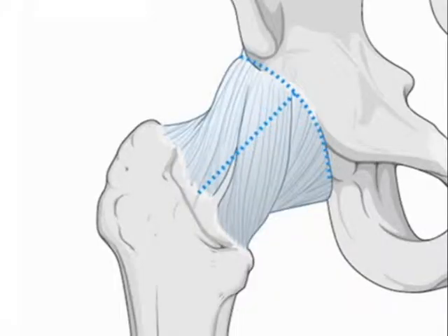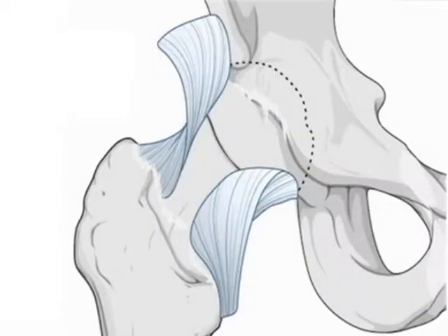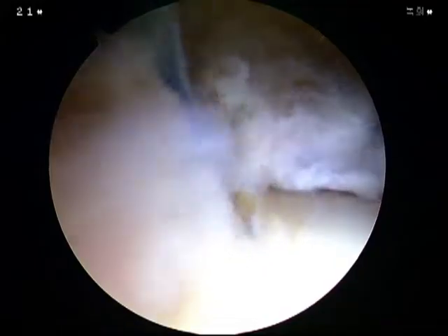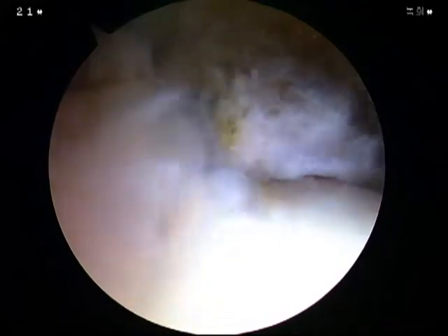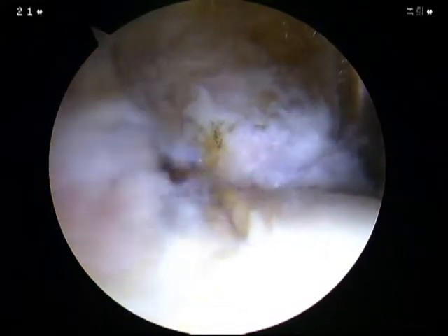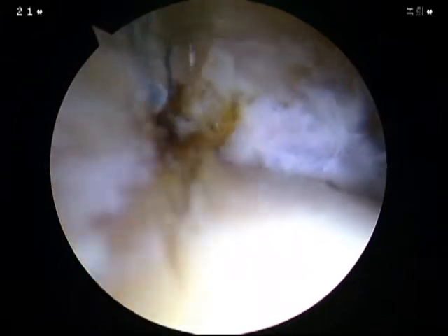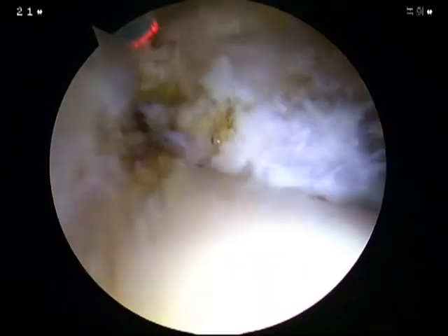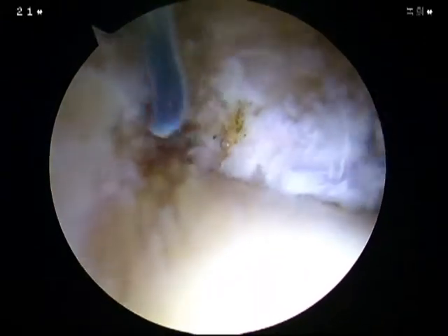T-shaped capsulotomy is performed to expose the anterosuperior CAM lesion of the patient. Capsulotomy using a hook-type arthrocare is being performed.